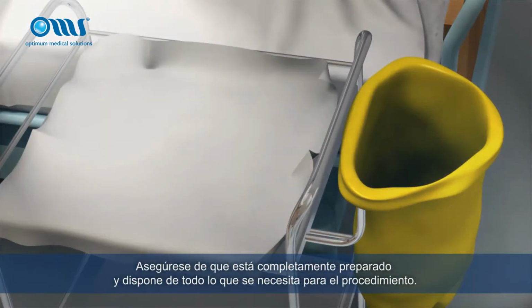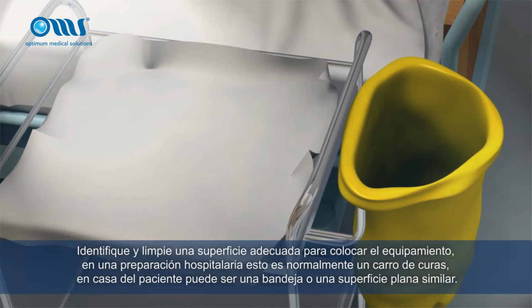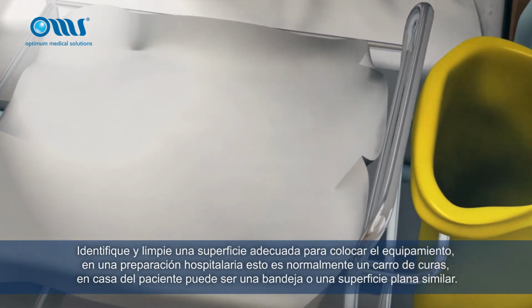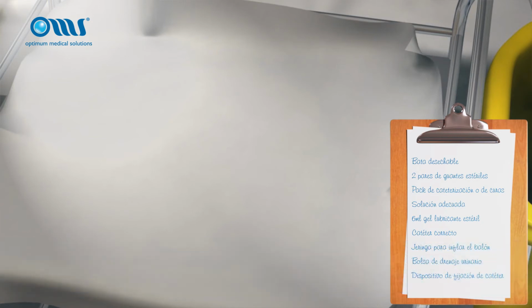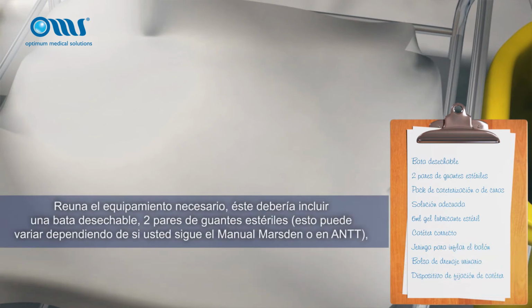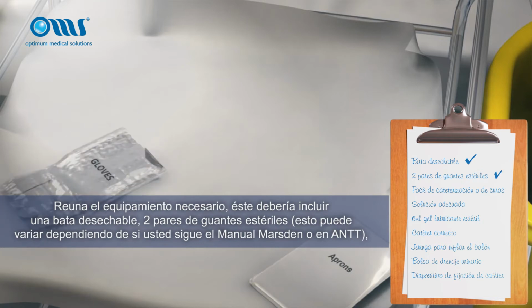Make sure you are fully prepared and have everything you require for the procedure. Identify and clean a suitable surface to lay out your equipment. In a hospital setting, this is usually a dressing trolley. In a patient's home, it may be a tray or similar flat surface. Gather the equipment required. This should include a disposable apron, 2 pairs of sterile gloves. This may vary depending on whether your trust follows the Marsden Manual or ANTT.